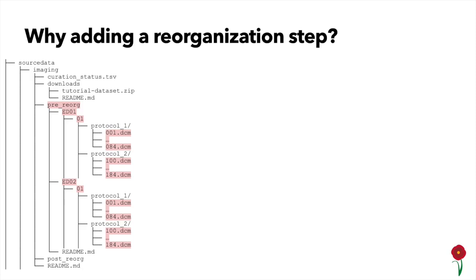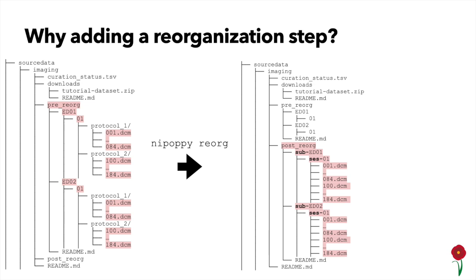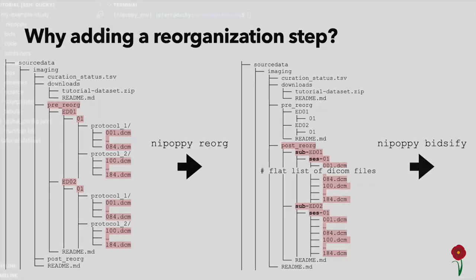So Nipoppy breaks this process down a bit more to make the data preparation manageable and less error-prone. More concretely, by this step, Nipoppy provides a unified way to deal with DICOM versus NIfTI source data, which simplifies BIDSification. It also helps fixing issues related to file naming, which often appear in chaotic data dumps or due to typos. Additionally, the organization simplifies tarring the DICOMs after BIDSification.